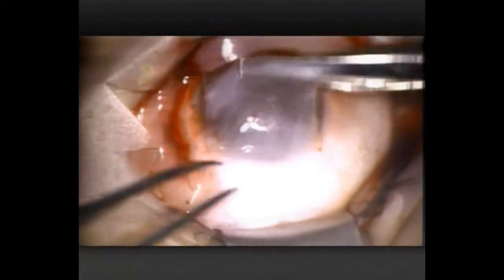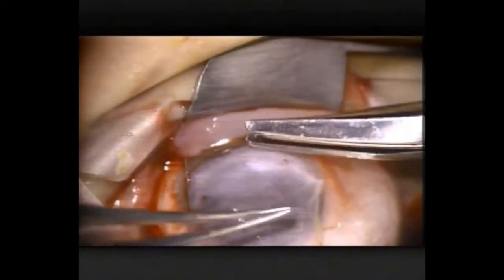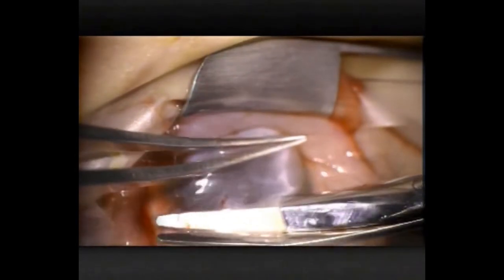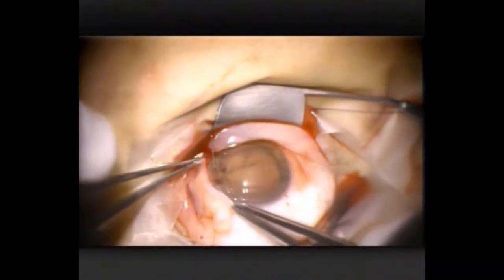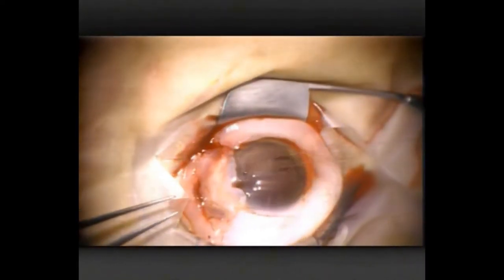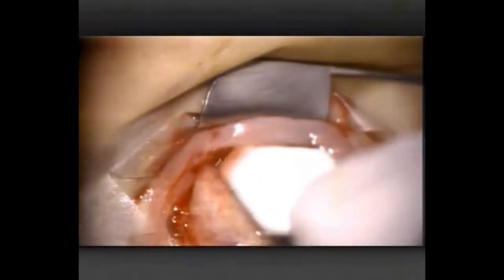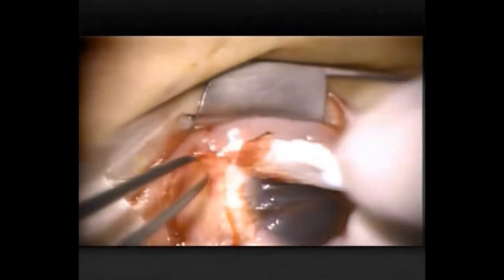Just reflecting back the flap that I've started to create. Often some pushing and sliding can further dissect this. This flap's quite reasonably thin, so I'm happy to just snip that off and move it around. Just picking it up and putting it into the position where it's going to end up, and now just repositioning the eye. Just clearing some of the blood away — you can see there's a graft there that's quite generous for the defect it needs to fill.